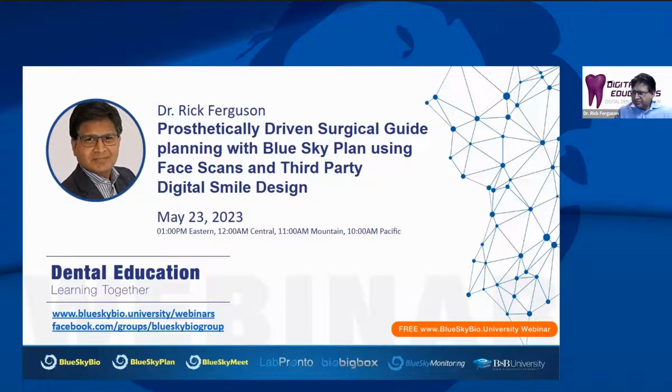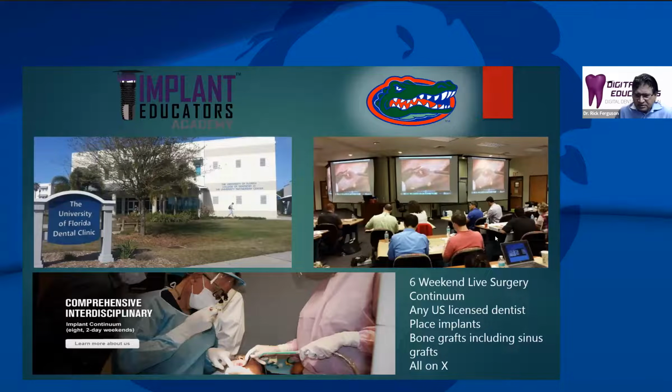As a matter of fact, Michael mentioned our implant continuum, and this is a continuum where doctors from anywhere in the US can come and place implants under our supervision. And we actually spend an entire day in this continuum teaching Blue Sky Plan software. That's the software we use to plan all of the cases.